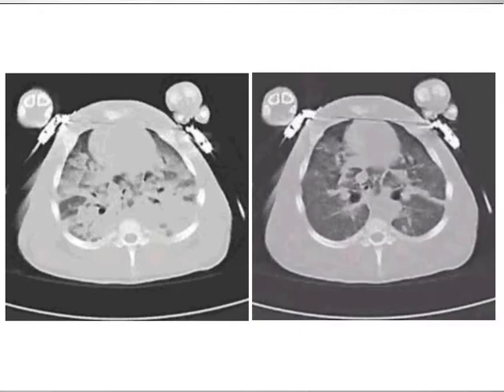So have we proven our hypothesis? It is important to say that this study is really preliminary, and the data are preliminary. We have not fully analyzed all data yet, but it seems to us that the dynamic compliance seems to detect collapse early. And we think it looks like the dynamic compliance is a valuable tool to recognize collapse.